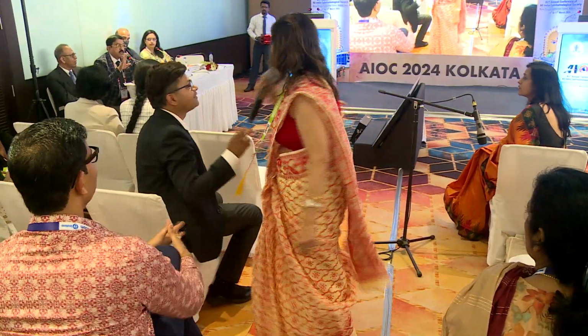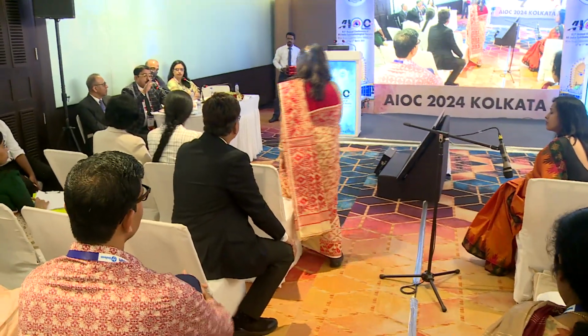And I would quite agree with this, sir. And the plaque or the epithelial cells that grow over a hyaloid face are much more difficult to YAG than a PC which has opacified. Anyway, a PC which has opacified is really very difficult. So a membranectomy has to be done through the posterior route. But I think a neatly done PCC and an anterior vitrectomy just as much as is required. But what happens most often, of course, for you guys, it's okay because you'll be doing it very often. A lot of them tend to do such an incomplete job that we have to go and complete it. Yeah. It's very, very messy.